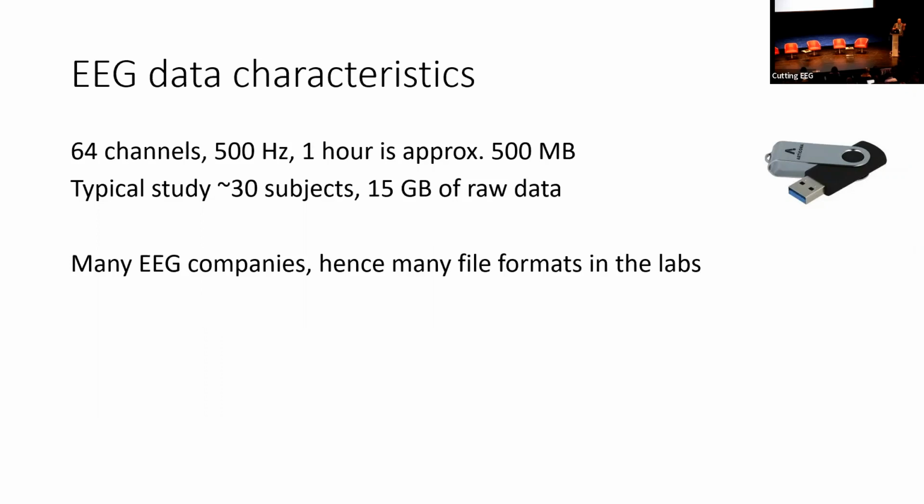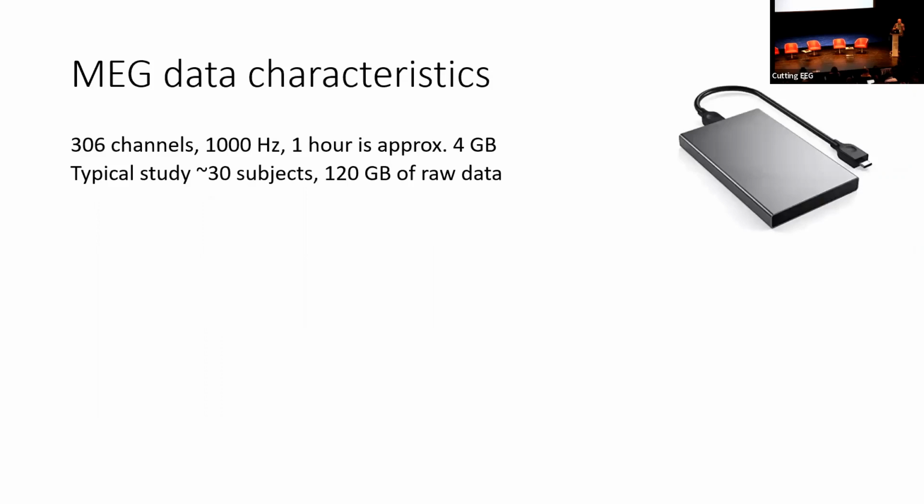With EEG, there are many companies. That also means that we have many different file formats.